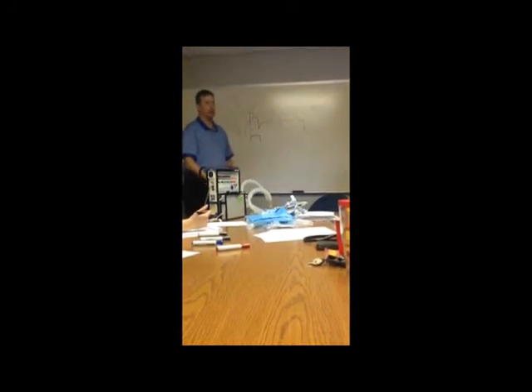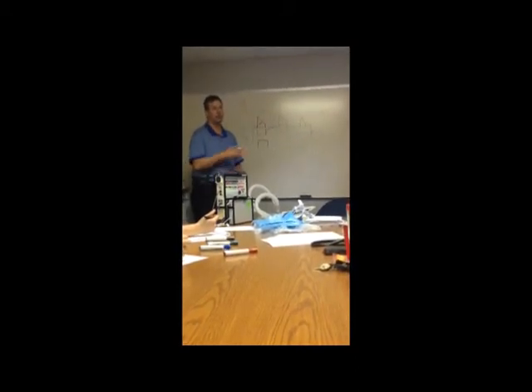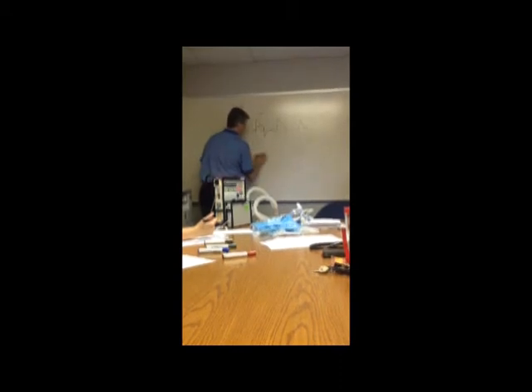Because technically the mode is assist control, but we don't say that. I report to the next person there on assist control, pressure control. And even though the pressure control is the breath type, it's not part of the mode. It's still listed in the name so they know what they're doing. All right. So that is assist control.